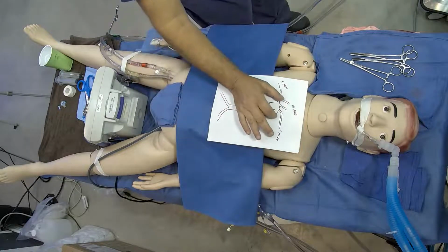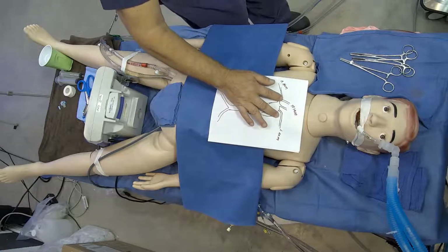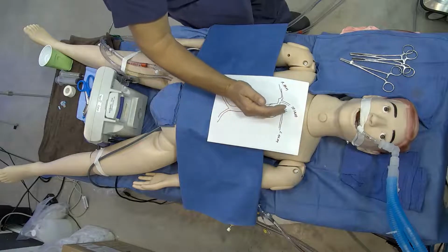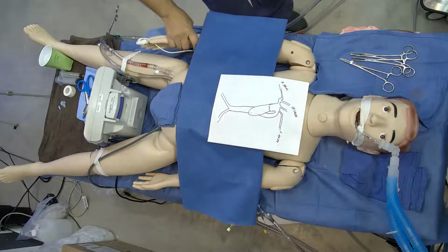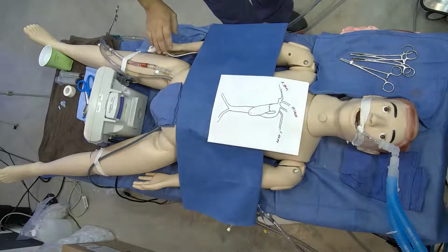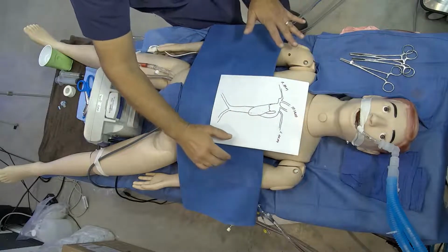So this territory that you see in this diagram, which would be in the chest, is the difference in where the blood is coming up and why it is so important that you measure the blood gases or you measure the pulse ox from the right side. This sort of lays it out for you.